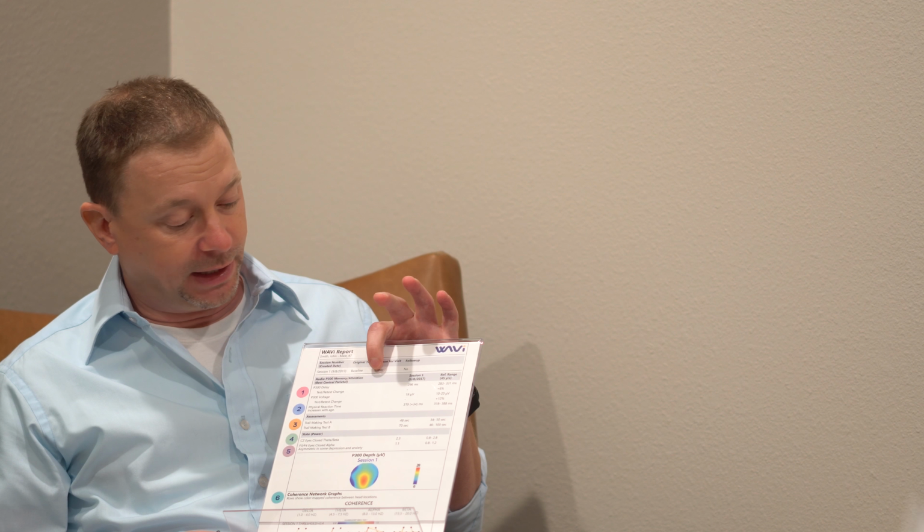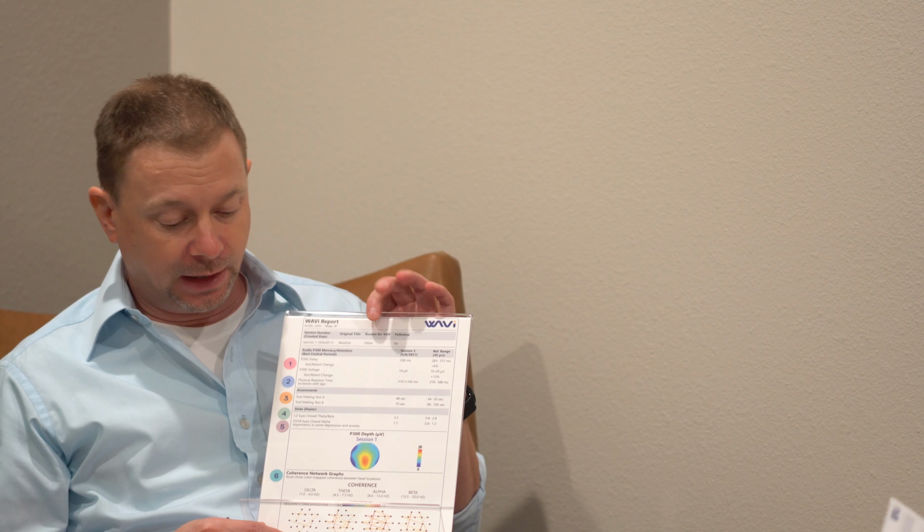This is a Wavi report, and it's a sample of what you can expect when you get a baseline scan or when you get an after-action scan when you've had an incident and you want to have your brain scanned. What you'll see in this report is sometimes the original baseline if you're only getting a baseline, and in some cases you'll get multiple graphs that compare multiple readings, because the computer can remember and compare your initial reading versus your follow-up readings.